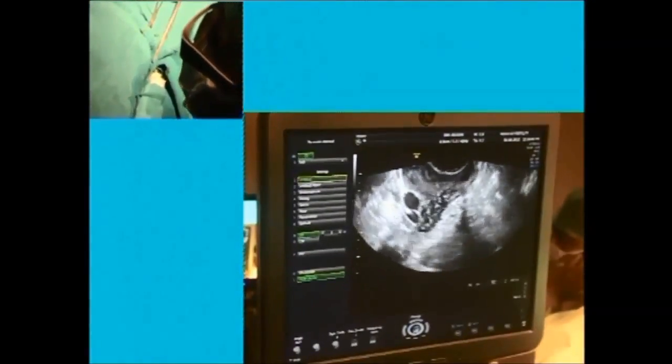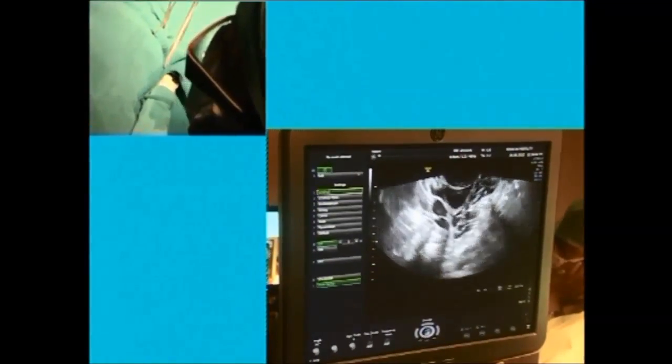Again, as Parul is pointing to the vessel, I am going to be sure that that is the follicle. Yes, definitely, this is the one.